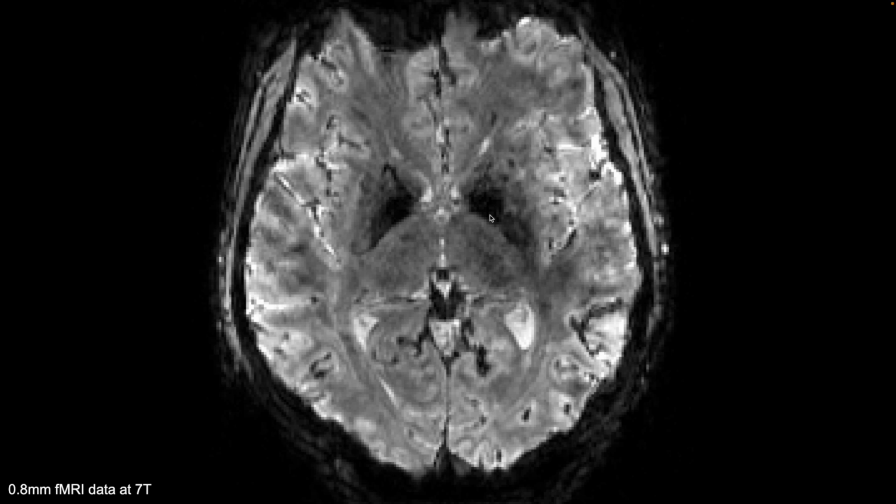There are more than 300 human layer-dependent fMRI papers published so far. However, despite all this, they are not quite perfect. It's hard to really put your finger on it because there's not an obvious ghost over there, but still you see that it's EPI. Independent of the distortions you see, it's not like FLASH, right? We have these shading patterns, like why is this part a bit darker than that part? And we call those artifacts fuzzy ripples.